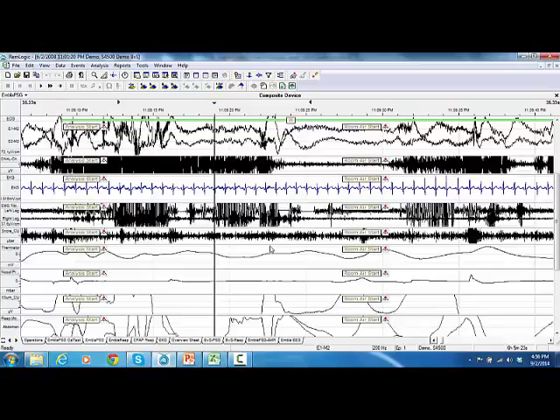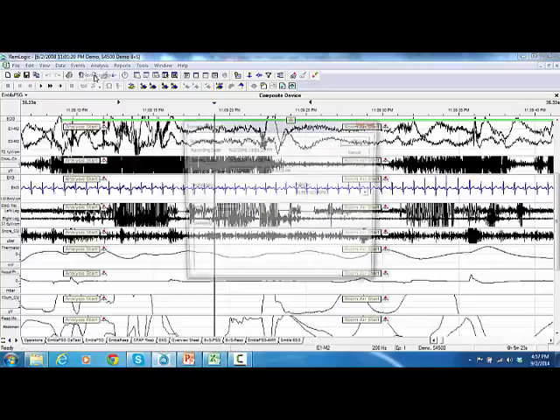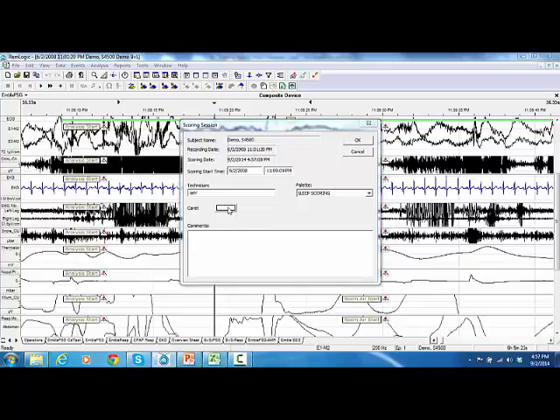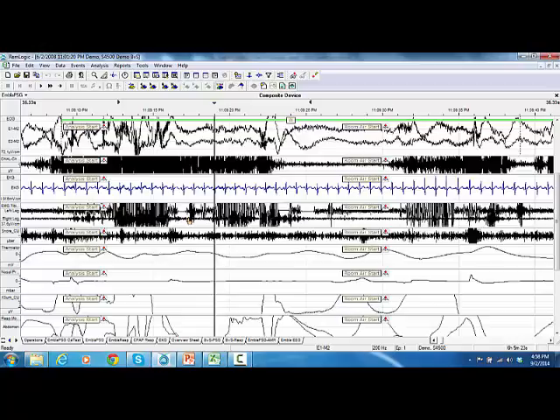If you want to create a new scoring session, from the menu bar go to Events and select Start New Scoring Session. The new scoring session window will pop up. In the technician box, type in the name of the scorer, change the caret if required, type in any related comments, then click OK.